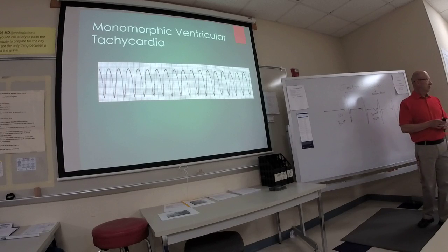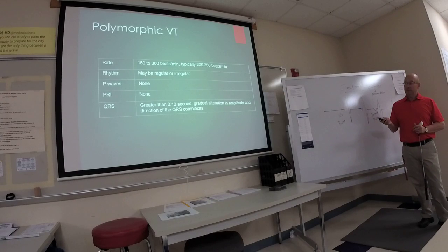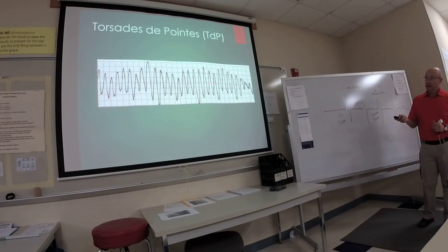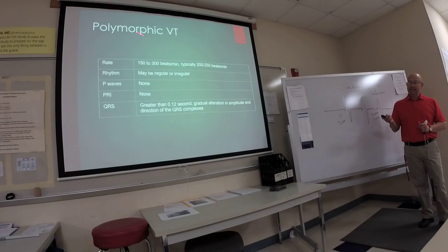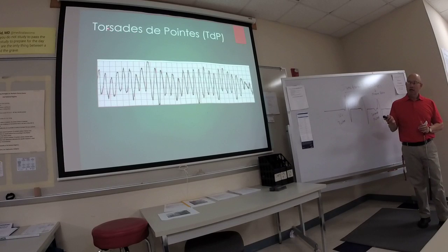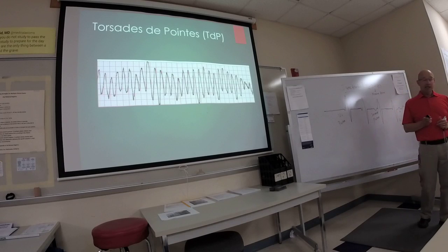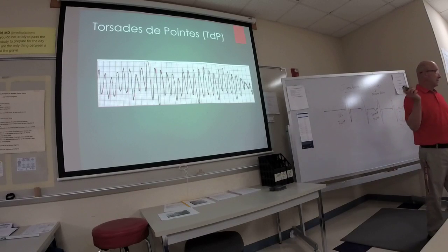It's one of the most recognizable rhythms around, except with polymorphic V-tac. The most common term for it is torsades.